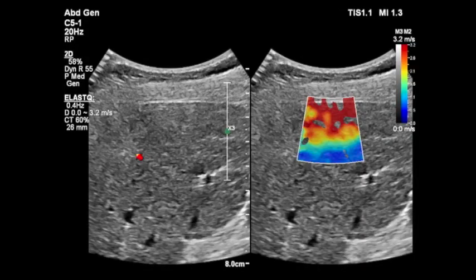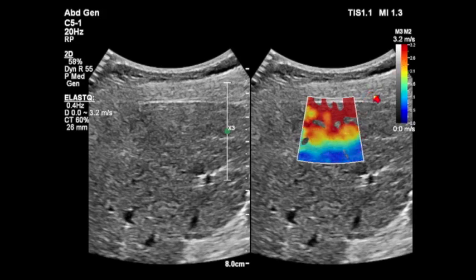Here is an example using a 2D shear wave system. In this normal liver, which should appear blue, you can see significant refractive artifact in the first 1.5 centimeters from the capsule. One advantage of 2D systems with color maps is that you can actually see how far the artifact extends — typically about 1.5 centimeters, sometimes up to 2 centimeters depending on the patient.